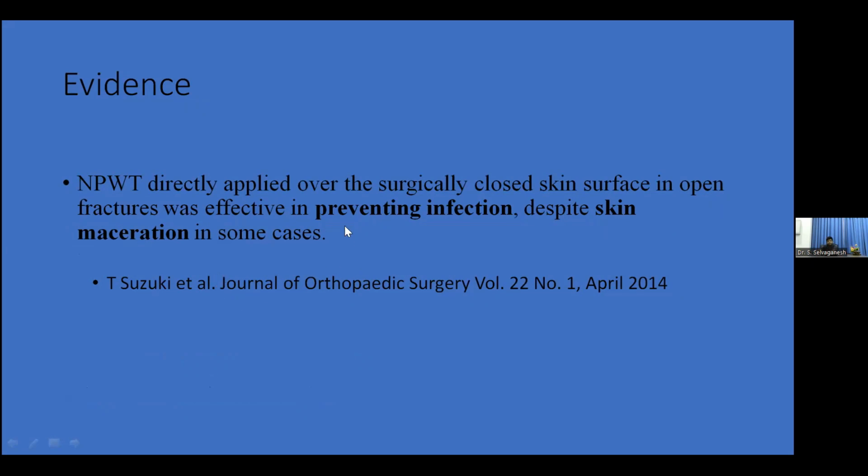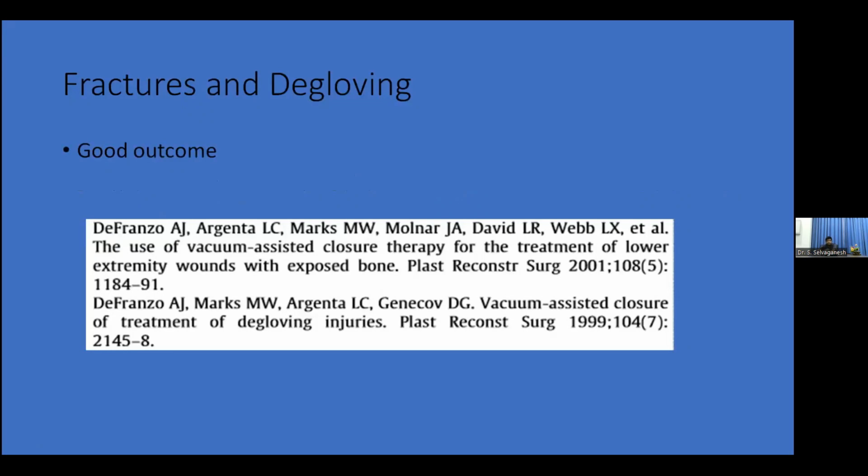This paper says they were able to prevent infection in open fractures, but there were cases of maceration. Again, in another paper, they found that bone-exposed patients got good results following a degloving injury, due to the vac dressing.